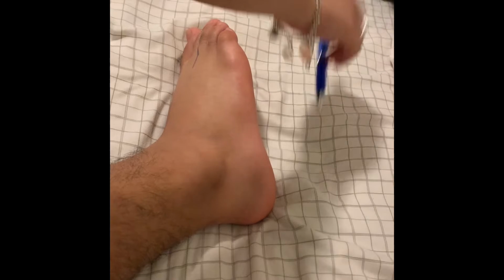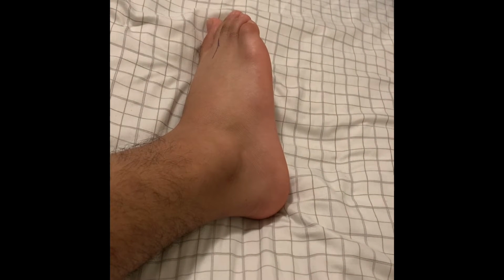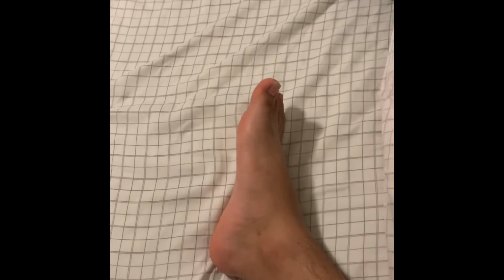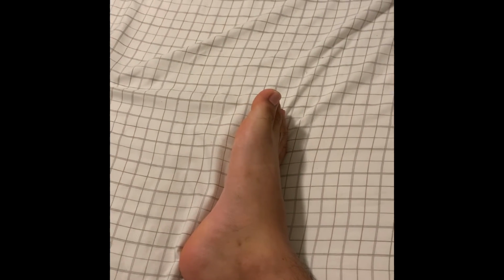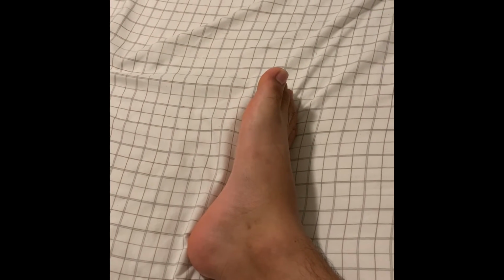Picture was taken, and now we're moving on to our lateral. So if you could please throw your foot that way, away from me, like that. Yes. Now we have the lateral position, which is like this. And I'm going to move your foot a little bit, sir, like that. That's fine. Okay. Now we have our lateral position.